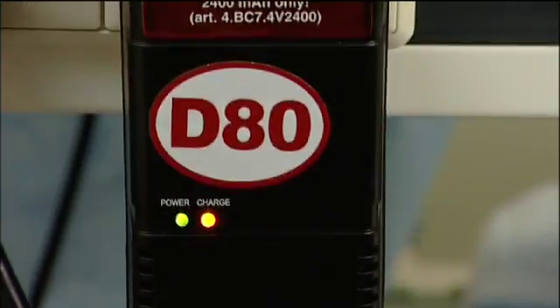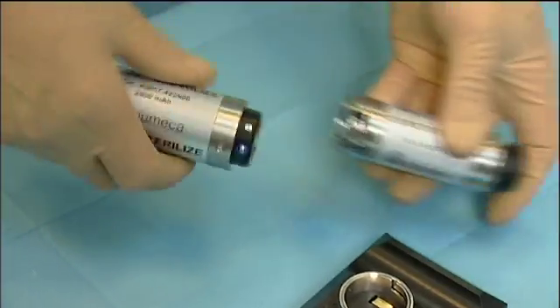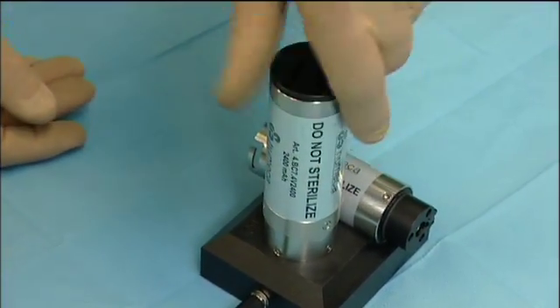Both dermatomes hold powerful rechargeable batteries. To charge them, they are placed in a so-called charger support unit. The motor is put down on the support unit to keep it at hand and prevent it from loss.